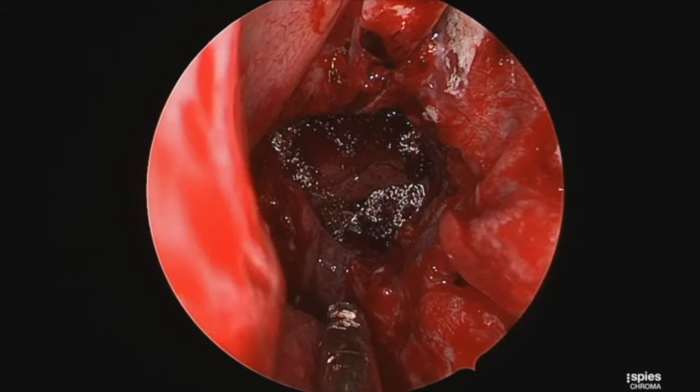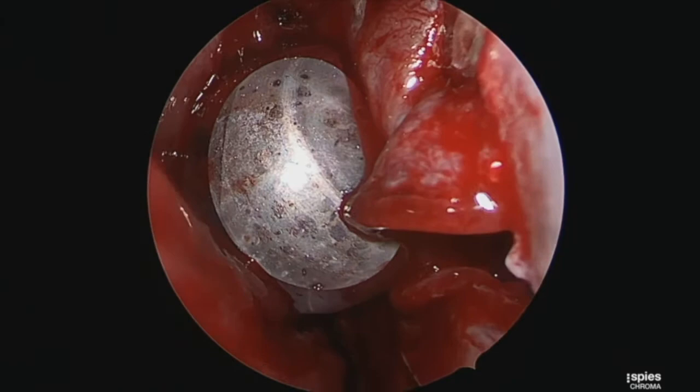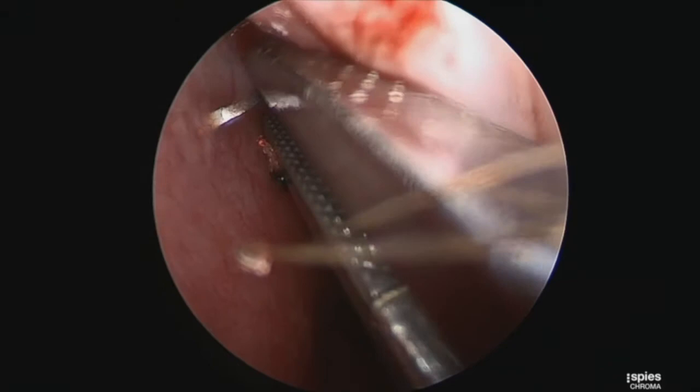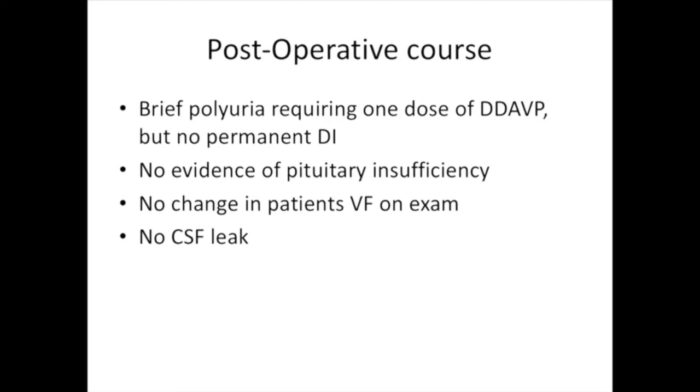Duragen collagen inlay is performed, followed by the nasal septal flap, which covers the defect widely. This is covered with Surgicel and tissue glue. A nasal Foley catheter is placed, and the free mucosal graft from the middle turbinate is placed onto the nasal septum to aid in remucosalization. In addition, the Caicedo reverse flap can be used.